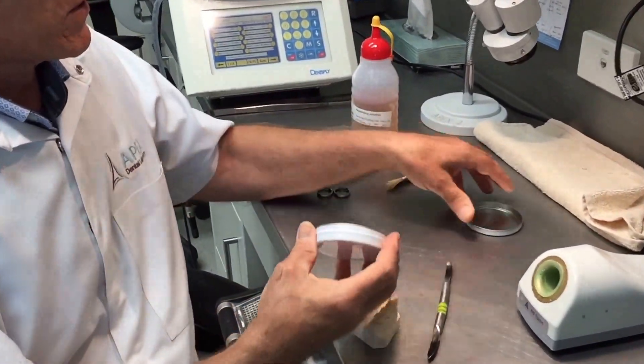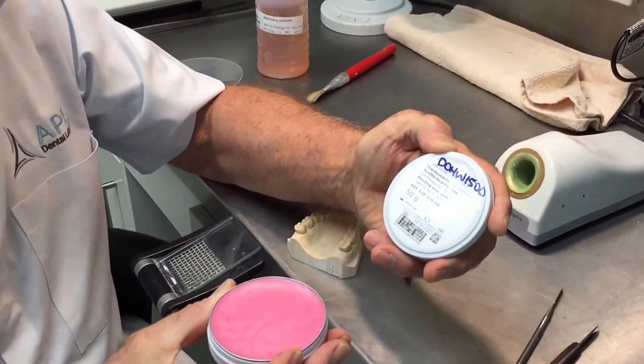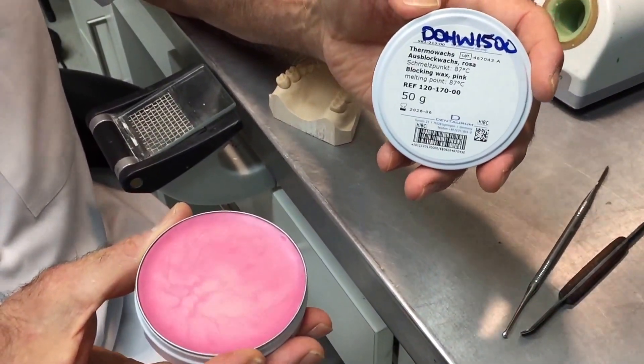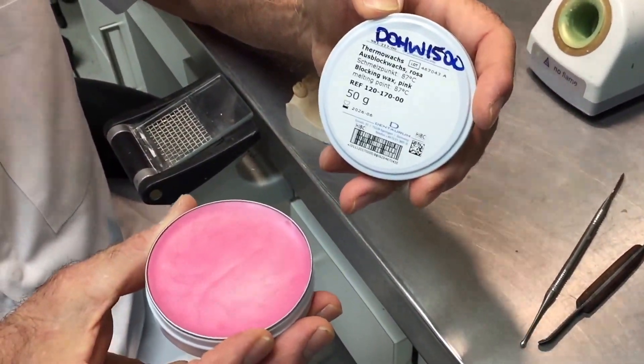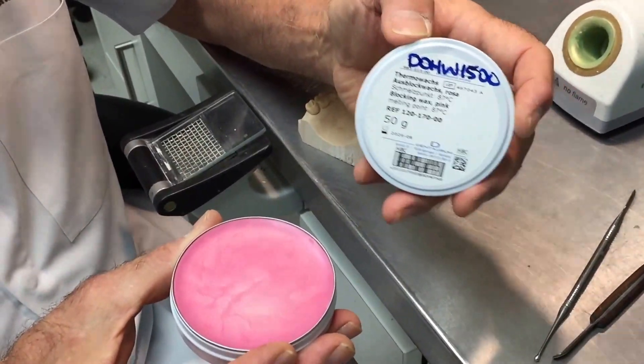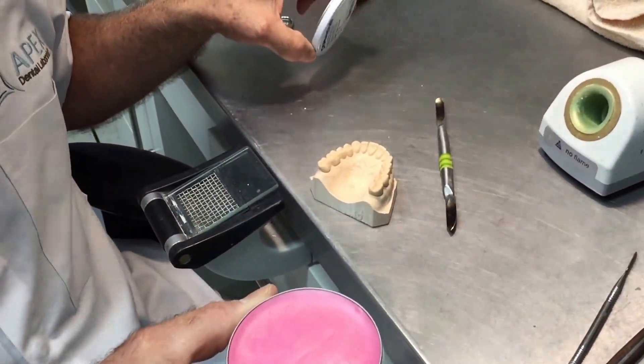The material I'm going to use as a spacer is called Thermo Wax. This wax is available from several companies, but it's a high temperature wax that doesn't distort when we're adapting the heated blank later on. Some products are resin-based, and the problem with those is that once you've placed them on the model you can't remove them effectively without damaging the model, so that model becomes a one-use model just for the bleaching tray.